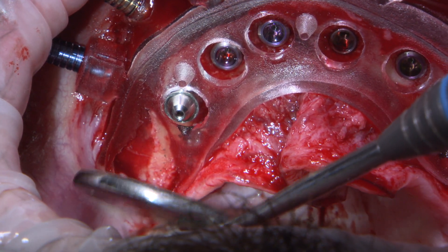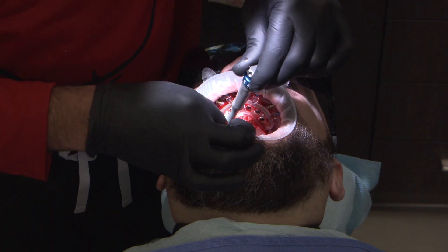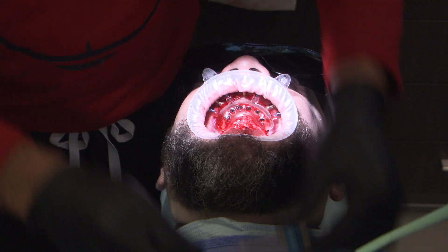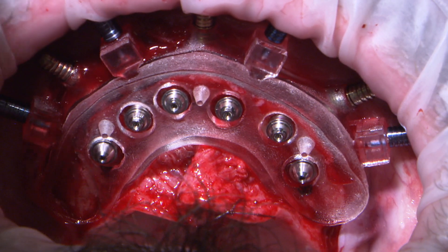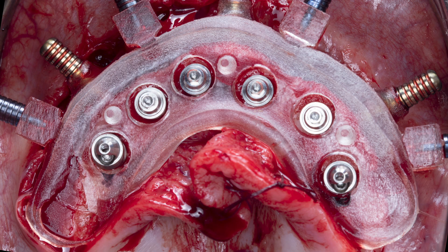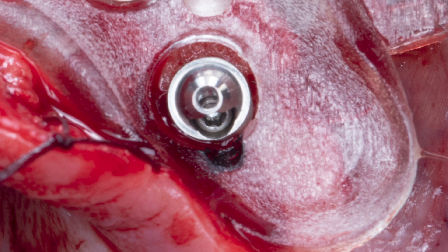Based on the torque and stability of an implant, the best loading protocol is determined. This can either be a cover screw, a healing abutment, or the multi-unit abutments. For this procedure, our goal is to insert these multi-unit abutments. The primary stability and torque value were sufficient for immediate loading, so we proceeded to seat the prosthetic delivery guide and secure it with the blue interlocking pins. The MUAs were then seated and torqued to 35 newton centimeters, which is the manufacturer's recommended torque value. The correct orientation of the angled MUAs was indicated on the surgical guide for ease of positioning.